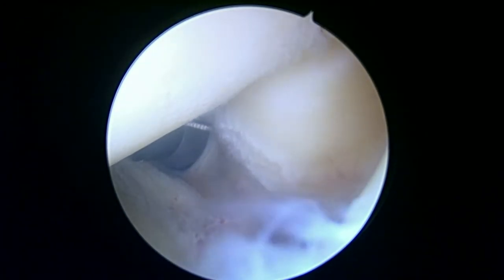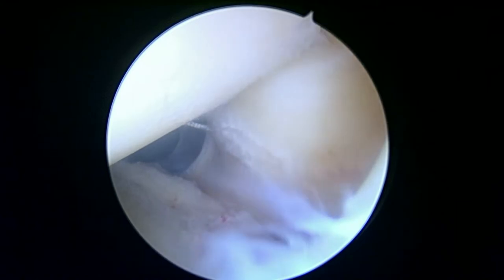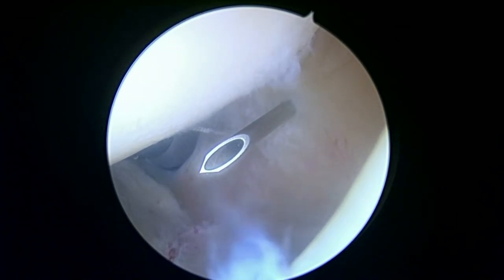So we'll put that there. And now we're going to use that spinal needle one more time, do the exact same thing, except this time we're going to be a little bit more anterior. And you can see where we're trying to get to. Now we'll have a look at that. Obviously you don't want to tighten things too much, but that looks pretty reasonable as what we sometimes call a ripstop stitch.